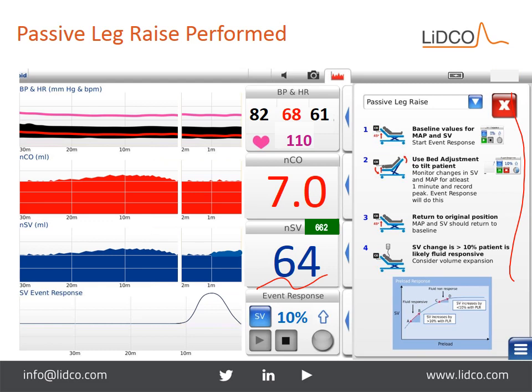150 to 250, 275-ish cc's of fluid. You can bolus from 2 lower legs into the central circulation. So this was a good thing. At least she's responding a little bit to that. Still vasodilated out.